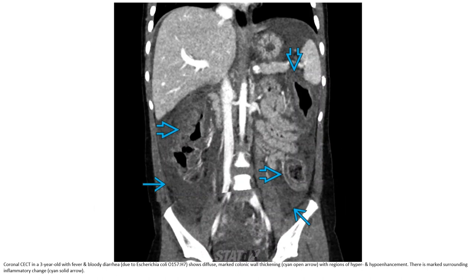Contrast-enhanced CT in a child with fever and bloody diarrhea shows diffuse marked colonic wall thickening with a region of hyper and hypo enhancement, and marked surrounding inflammatory change.